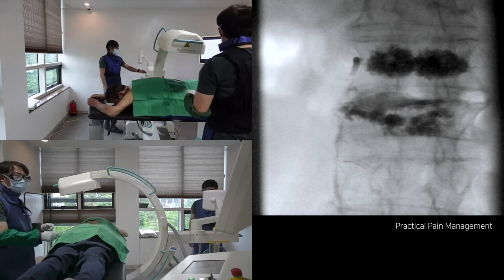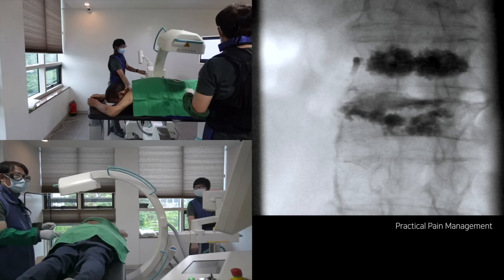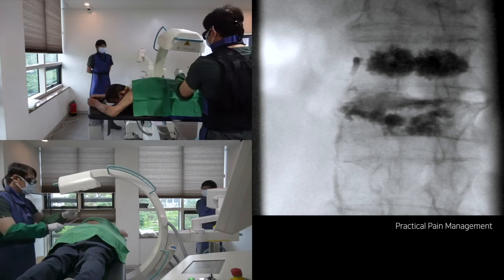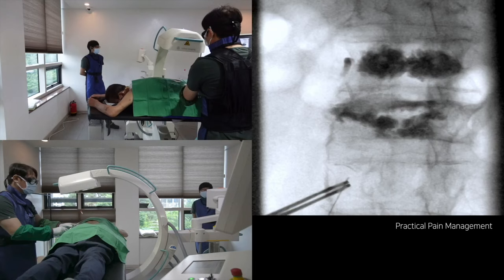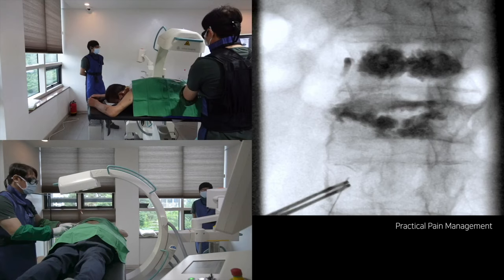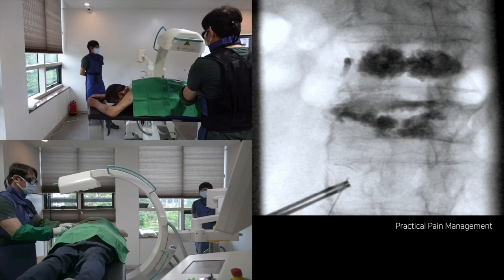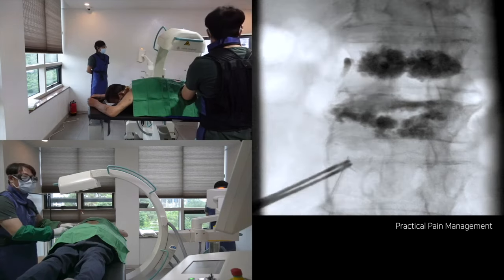We cannot expect a precise sub-pedicular or infra-neural approach in the severely deformed spine. It will be a survival mode — it means I must place the needle to the intervertebral foramina and infiltrate the injections into the foramina and epidural space. Let's go!